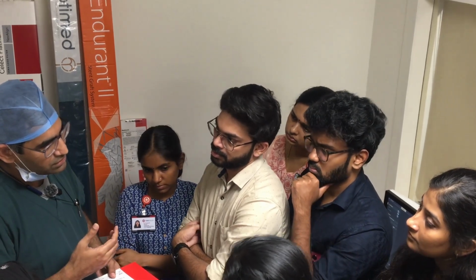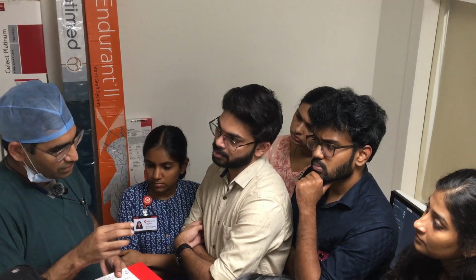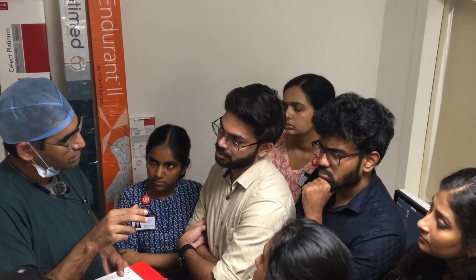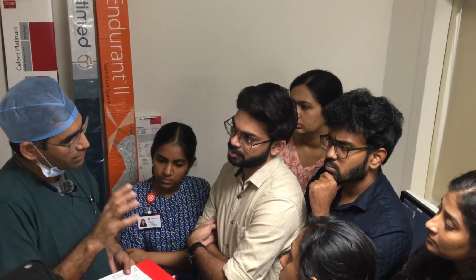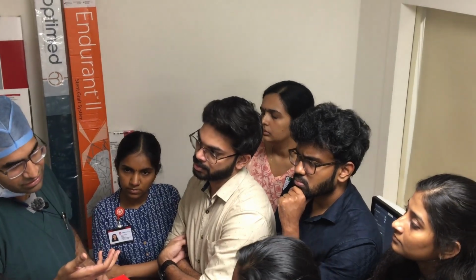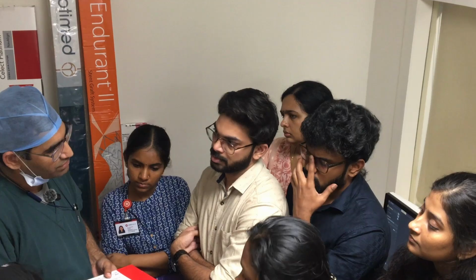The aortic balloons will take the shape of the aorta, and even if you push too much, the radial force will remain the same. It will only elongate upward and downward, but the radial force is designed like that so that you don't rupture the aorta just because we are hyperinflating.